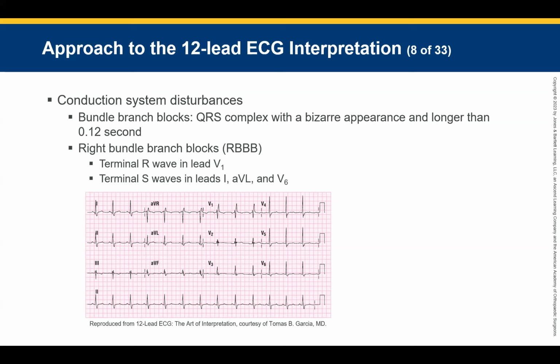So now, when we're talking about V1, we're looking at the QRS width. Here's a really cool factor. When you do a 12 lead, your computer 12 lead prints stuff out. It prints out some analytics, some details. And one of the things it prints out is, typically it's called QRSD. You guys ever see that QRSD? QRS duration? That is the width of the QRS in V1.